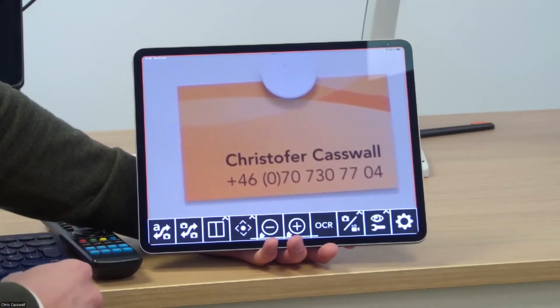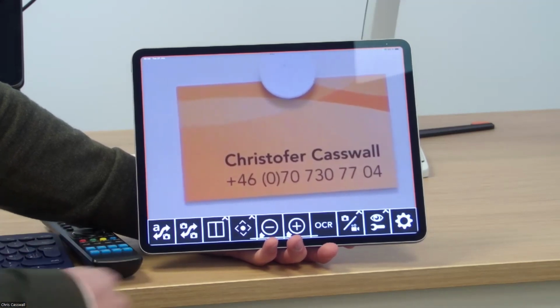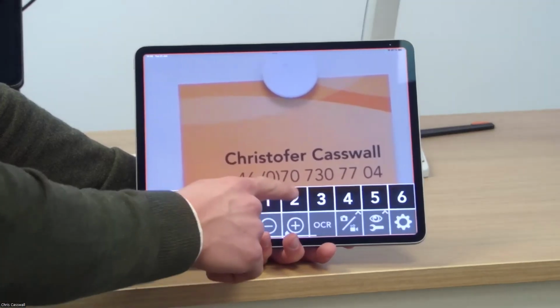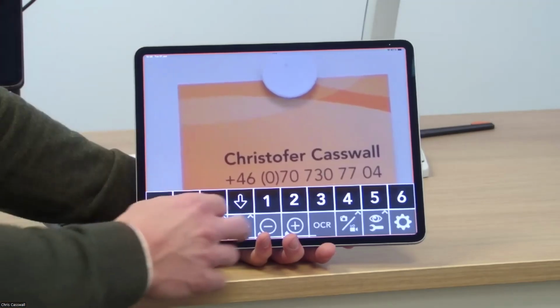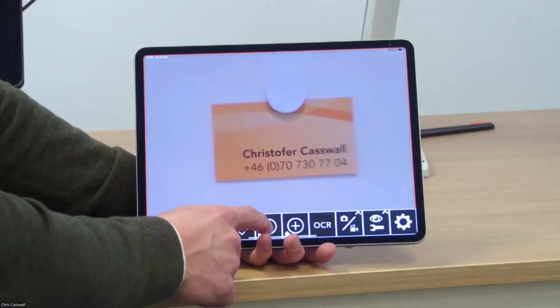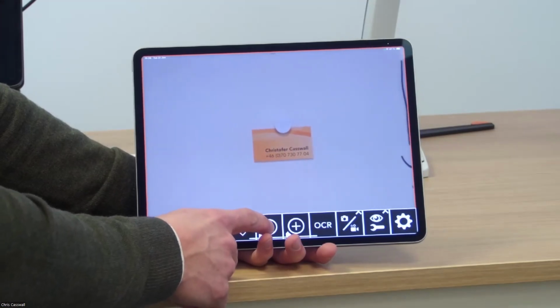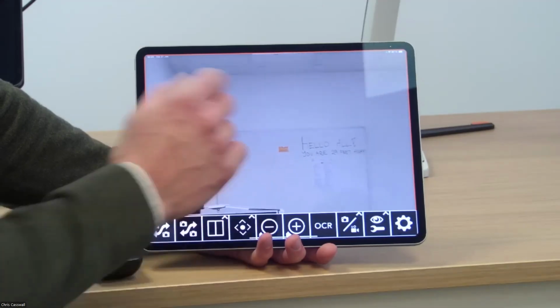So if the teacher would move now from the blue square to the green square on the board, then the student knows that, oh, the blue one is on preset number 2. I don't have that now, but they press number 2 and boom, they will be there. Some examples on when that could be useful, and I have now shown you how powerful this little camera is.